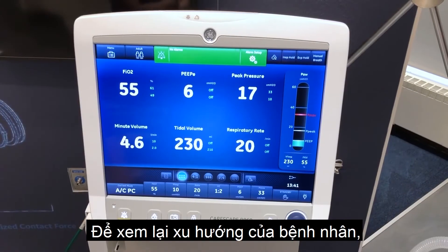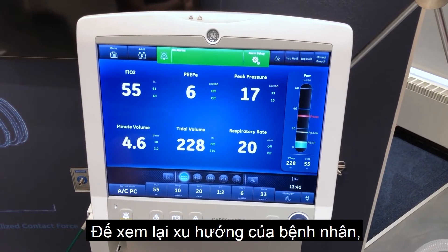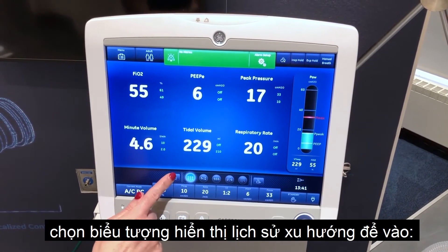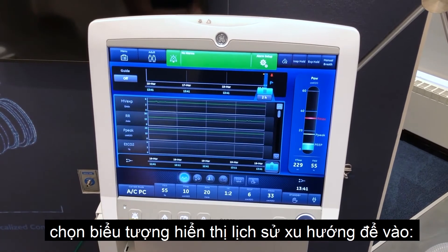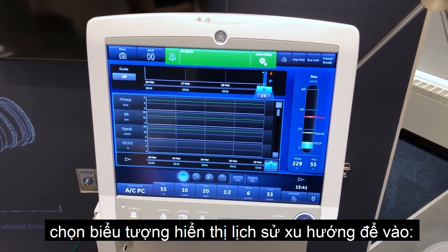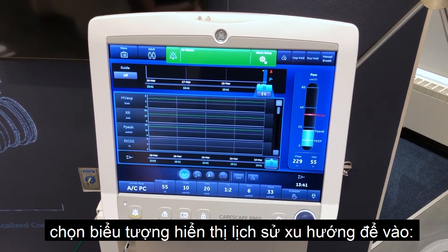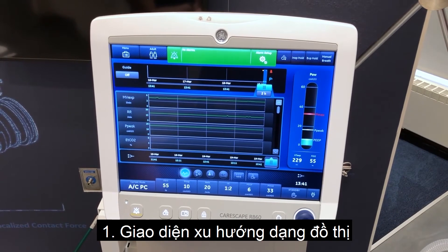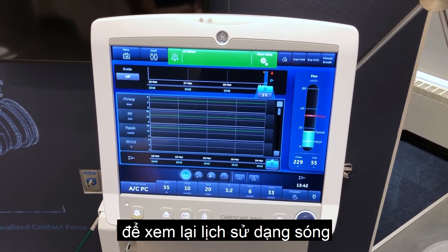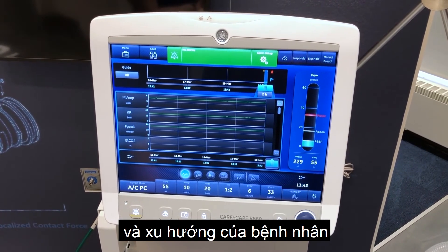To review patient trends, touch the icon to display the historical trends workspace. Select historical trends workspace for access to graphical trends view to review historical waveforms and patient trends.